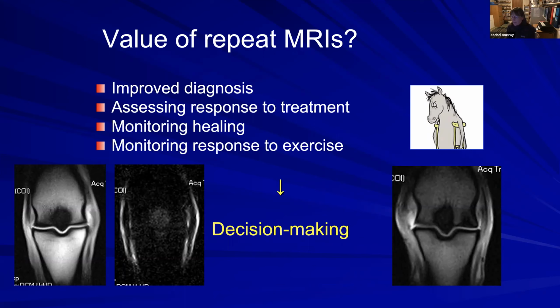So bone injury is the easiest one to follow, but that still could be your deep digital flexor tendon injury. What's happening to the navicular bursa adjacent to the deep digital flexor tendon injury that may not have involved the dorsal margin before, but actually it does later on.